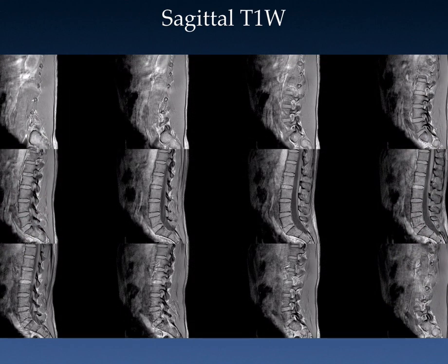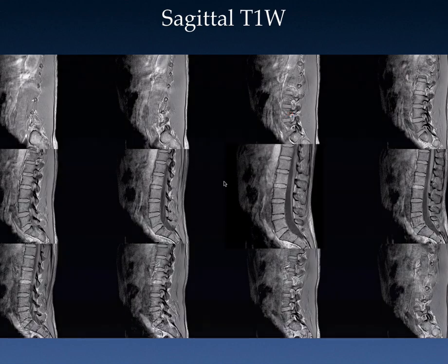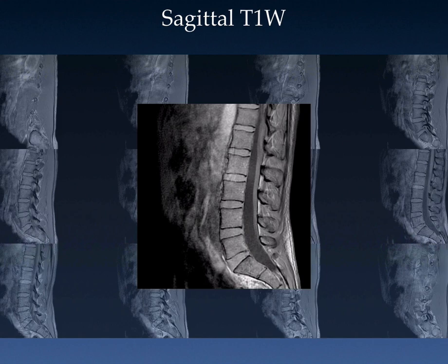Here are some images from that — 12 images out of the 14 slices we acquired. We maintained standard imaging coverage and spatial resolution parameters, as well as image contrast. We are able to cover side-to-side very adequately with good contrast at the articulation processes and facet joints. You can see the nerve roots well within the surrounding fat, and good contrast between the cord and the CSF, as well as the intervertebral disc and the spinal canal/CSF interface.